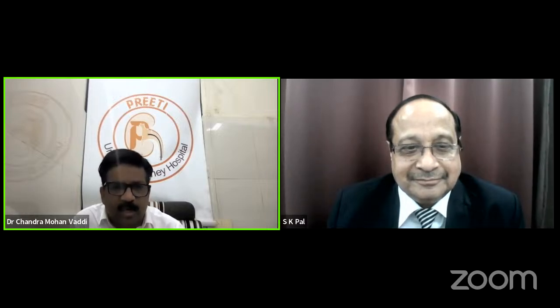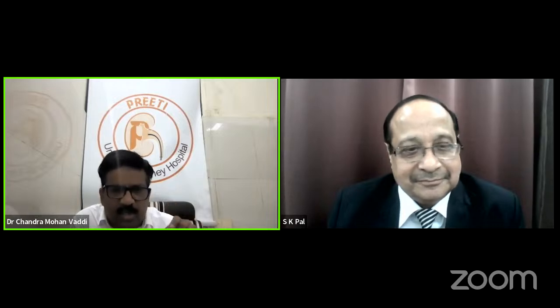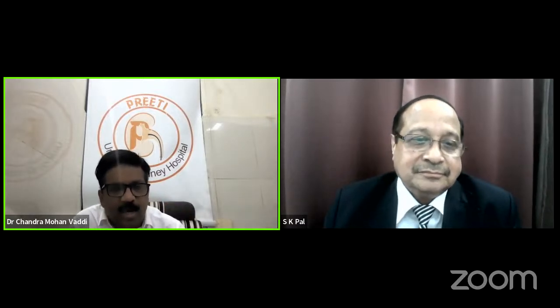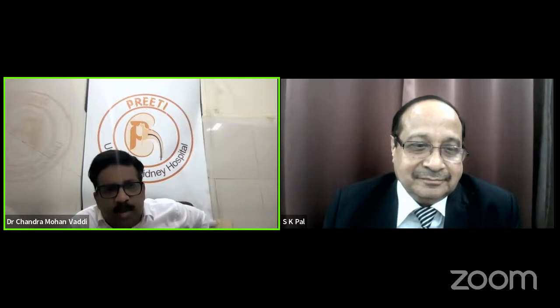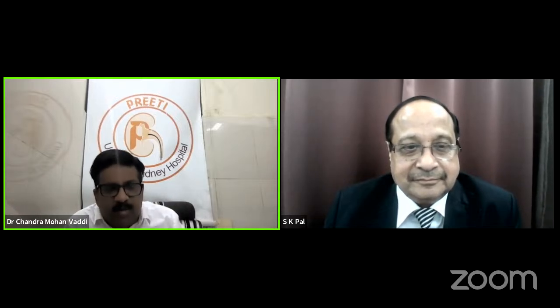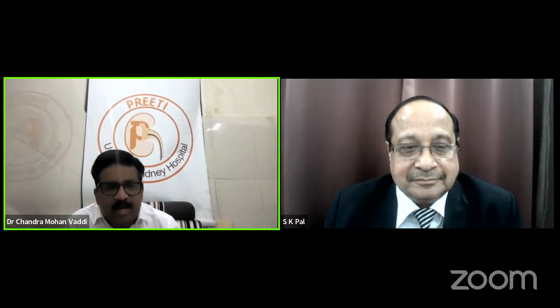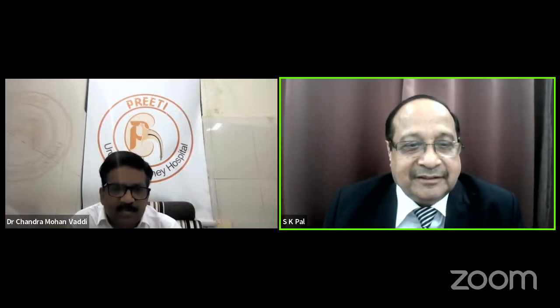If you remove it on the third day, hardly do you see a horizontal scar, only a vertical scar, depending on the patient's collagen characteristics. But I have not seen somebody saying, why have you made such a big cut in PCNL? I have never seen. I also have 20 years of experience, and no lady in any part of the dress will see that. So logically, apart from the logistics of infundibulum and removal of the stone, does a smaller size tract have any sense in terms of pain as well as cosmetic concern? This 3 millimeter versus 9 millimeter is just a gimmick.